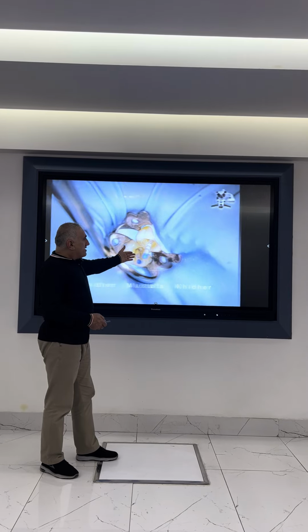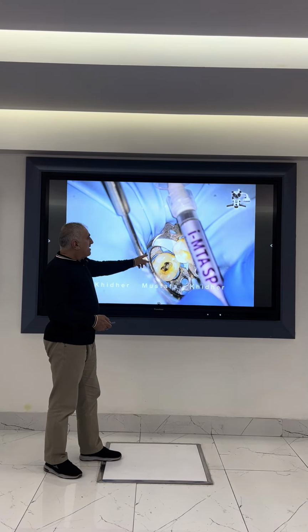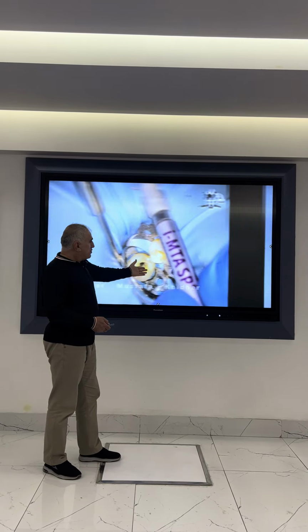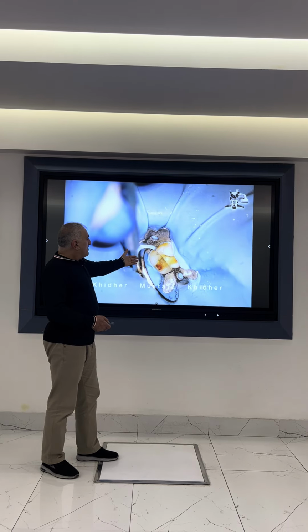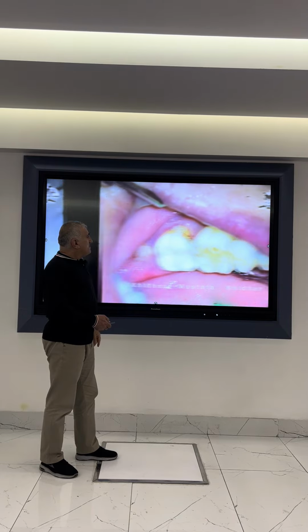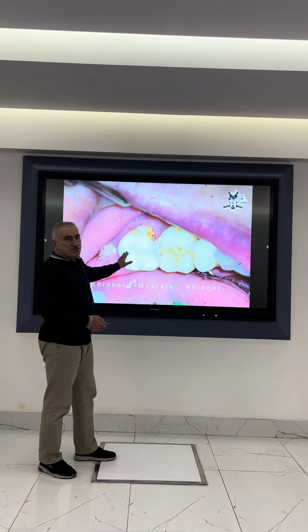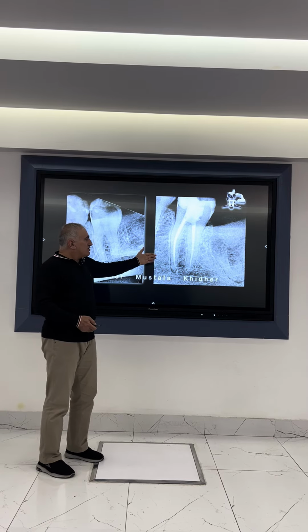Then I dry the case. For the mesial canal, the drying is with the taper 4. Then I am using a bioceramic sealer, and the canal is ready. Then final obturation. Then I remove the mesial caries that I already had. So I finish the case with the final restoration with composite. And this is the preoperative, and this is the postoperative for the case.